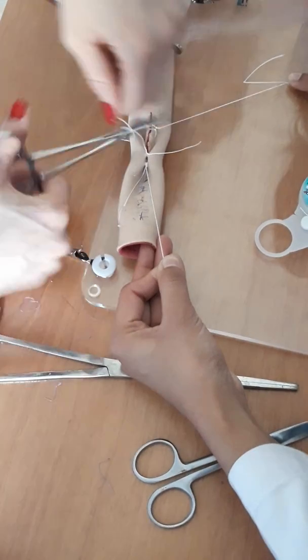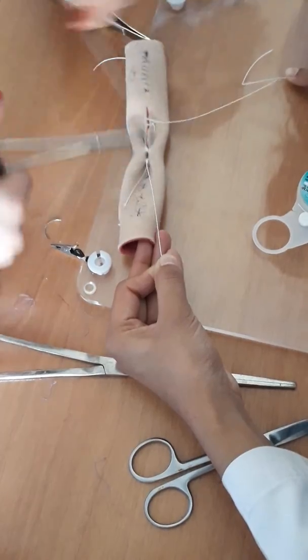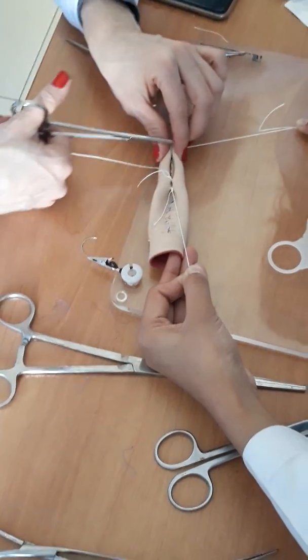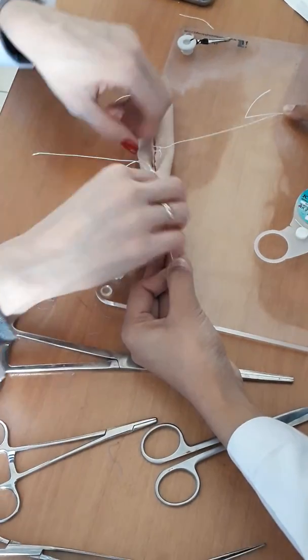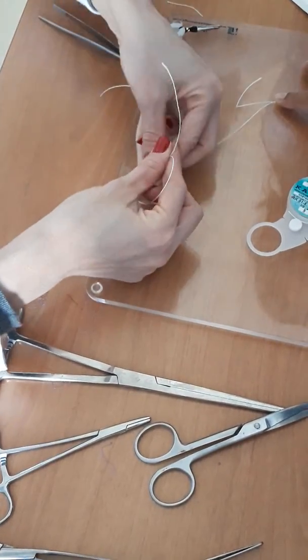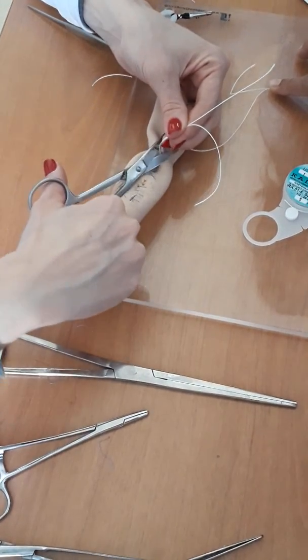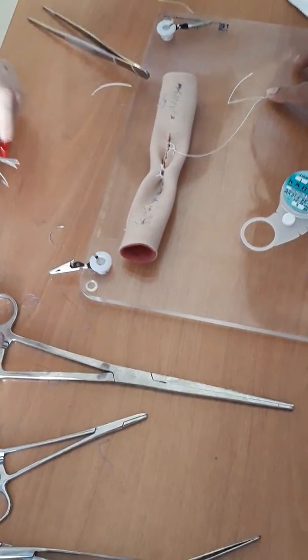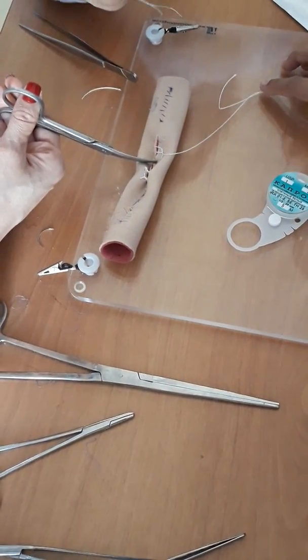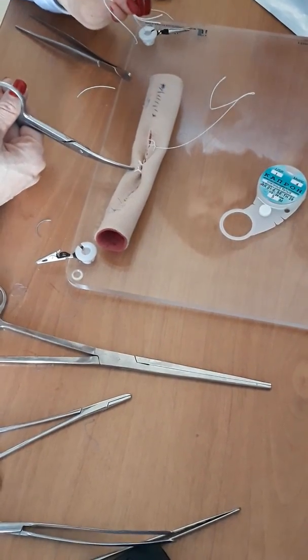Do you understand me? Yes. 2 times. 3. Better 3. And make. Now, for example, 1, 2, 3, 4, 5. Here, maybe. After that, you should take this filament together, take scissors and cut. Do you understand me? Yes. This is the first row, interrupted penetrating suturing. This is interrupted non-penetrating suturing. Do you understand me?